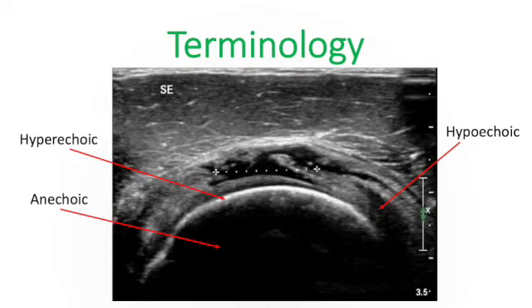So that's a little fat pad. What happens there is the majority of ultrasound waves are reflected back, but also a good number of them are absorbed. So it shows up just a little darker. And then anechoic means there's nothing getting through, and that's what we see deep to that bone interface. So definitely make sure you understand this slide in those terms.